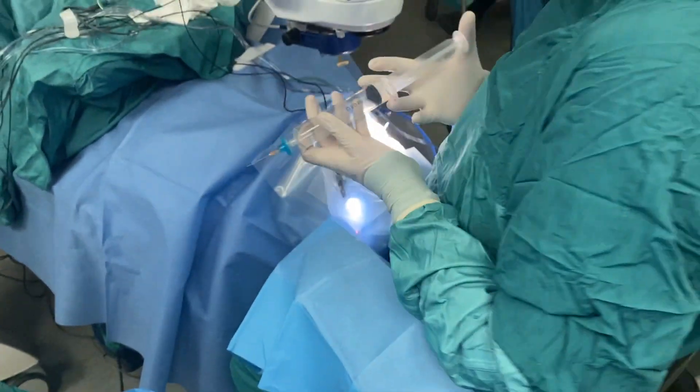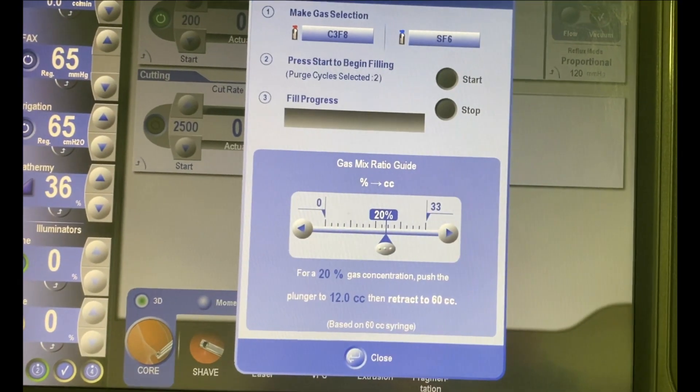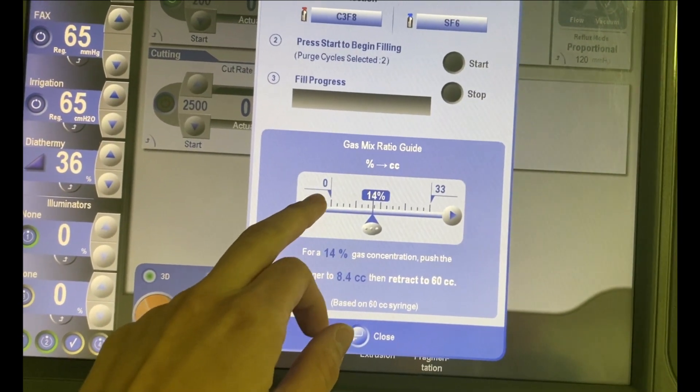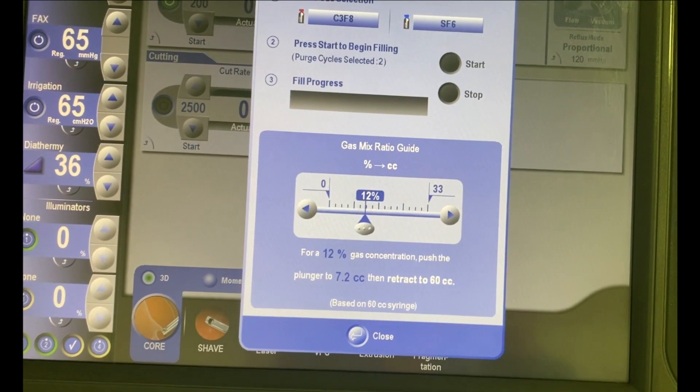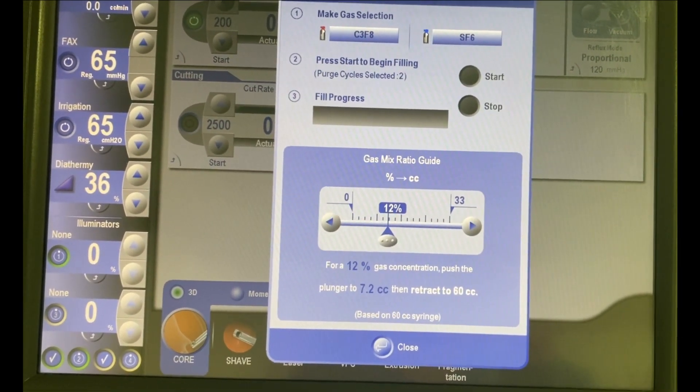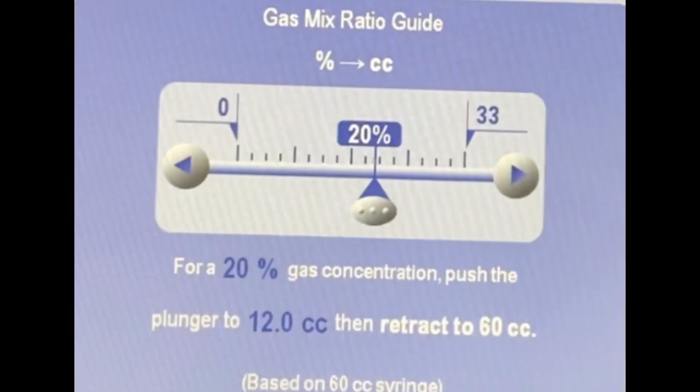Appropriate dilution calculation of gas is crucial for good endotamponade. If gas has a lower concentration than needed, endotamponade will be less effective. If gas has a higher than needed concentration, its expansion can cause significant elevation of intraocular pressure and related complications. Some vitrectomy systems provide a gas mix ratio guide to calculate the correct dilution for the desired gas. The guide shown here is based on a 60 cc syringe, and different concentrations of final gas can be chosen. According to this, the guide provides information about the pure gas volume that should be left in the syringe before air aspiration.